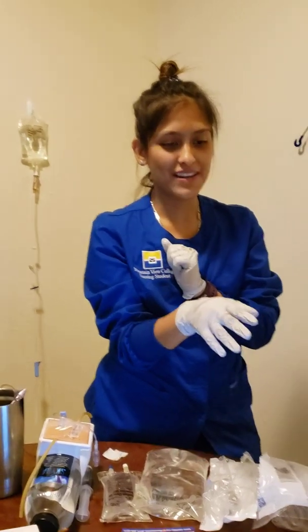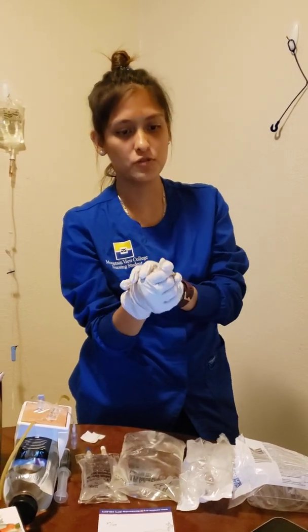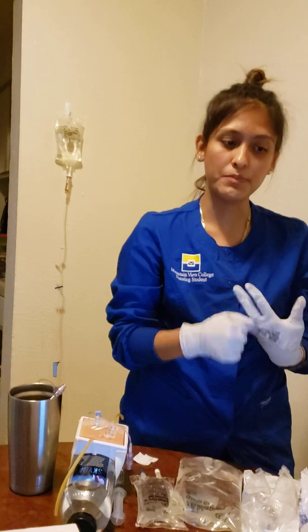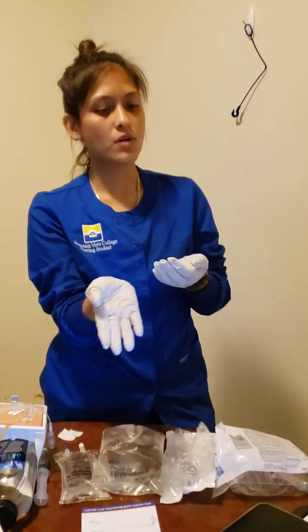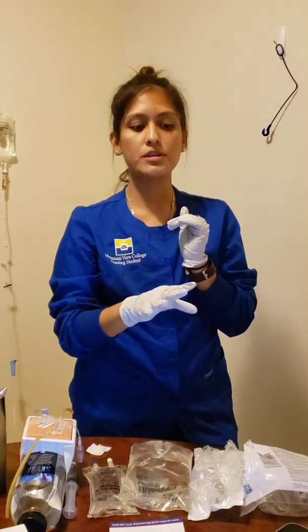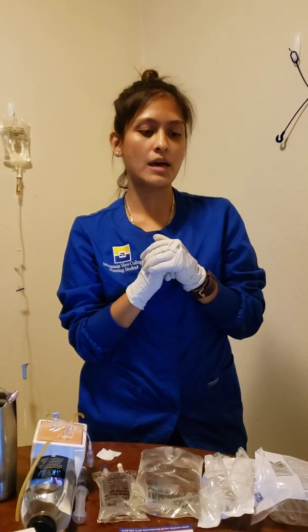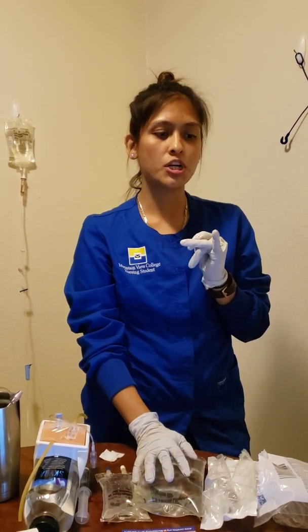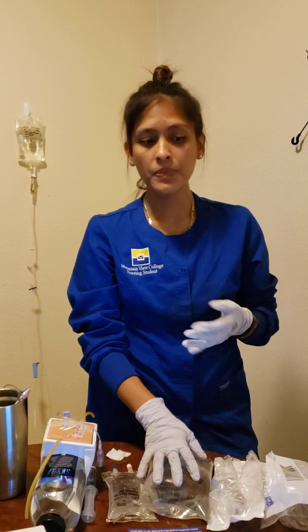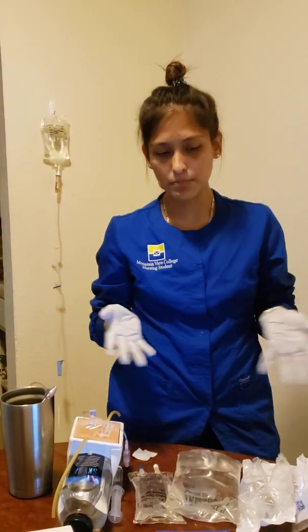I'm also going to give an 8 o'clock ampicillin, 500 mg IV piggyback to infuse over 30 minutes. No allergies, everything matches, everything looks good. While I have her orders up, I'm also going to look at her lab results and make sure that I'm able to give this to her. Also, her vitals were done like 5 minutes ago and she's stable. So I'm ready to go into the med room to get my supplies.